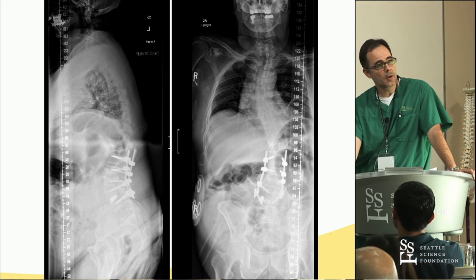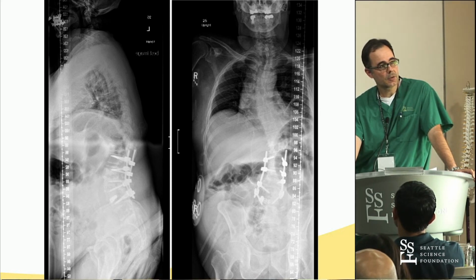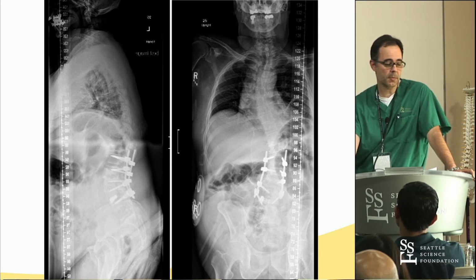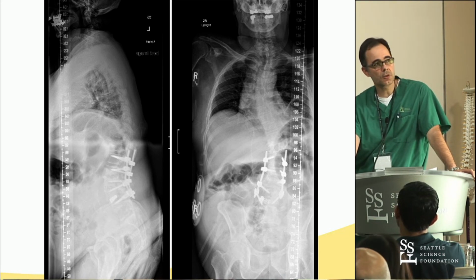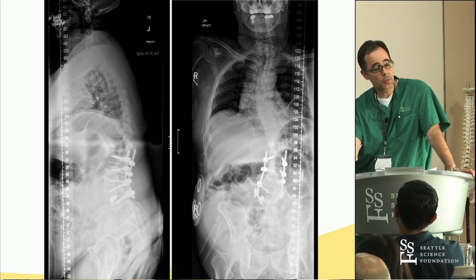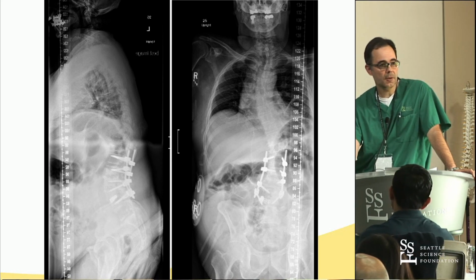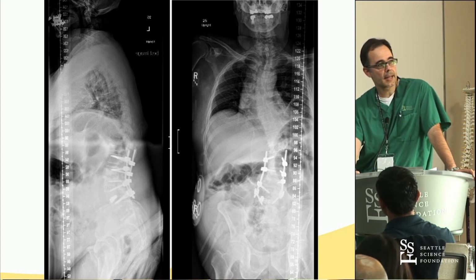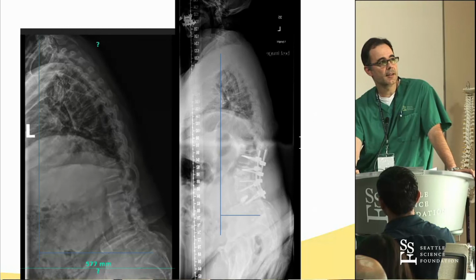We were able to do a partial correction of his deformity, and I attempted to get a trajectory into the L3-4 disc space. This patient was actually fused from 4 to 1 spontaneously, and L3-4, 2-3, and 1-2 were the areas that I attempted to do through the lateral approach. We achieved 1-2 and 2-3, but at 3-4, there was too much activity from the EMG, so we aborted the 3-4 and just did a TLIF posteriorly, and much better than he was pre-op.